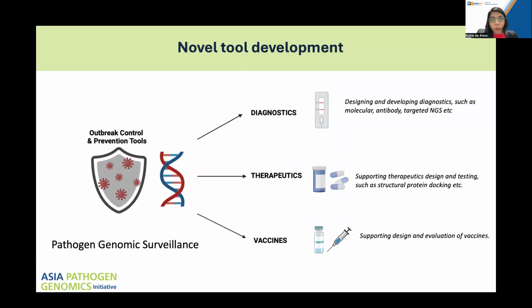It can be used for diagnostic purposes. It can be used to look at whether therapeutics are still working against new variants. It can also be used to design vaccines.